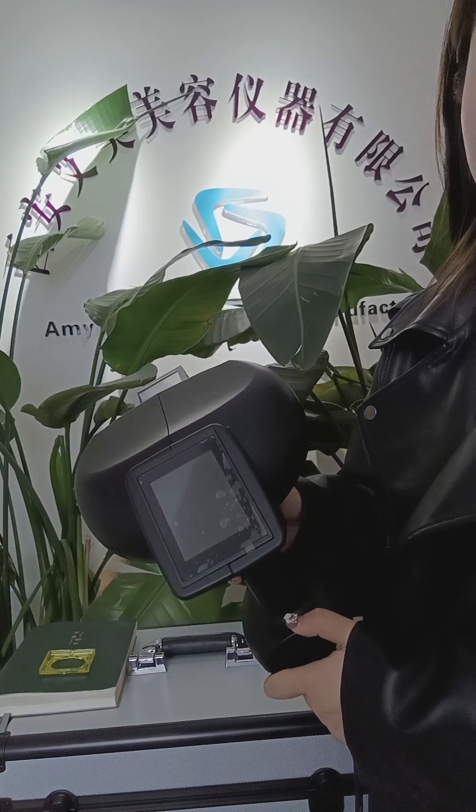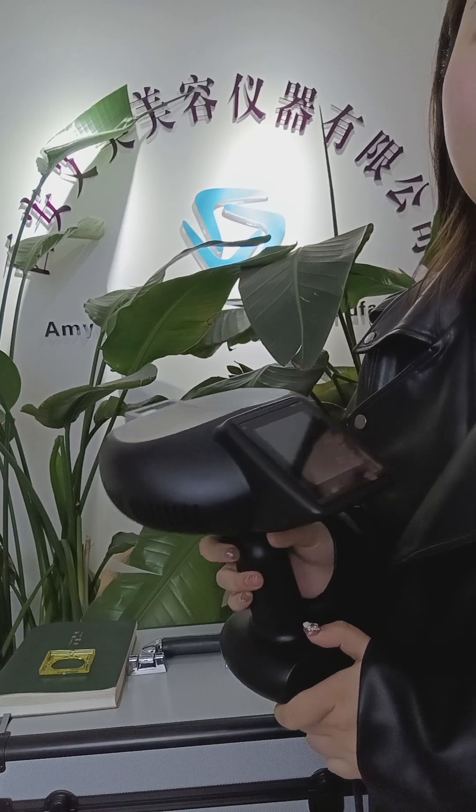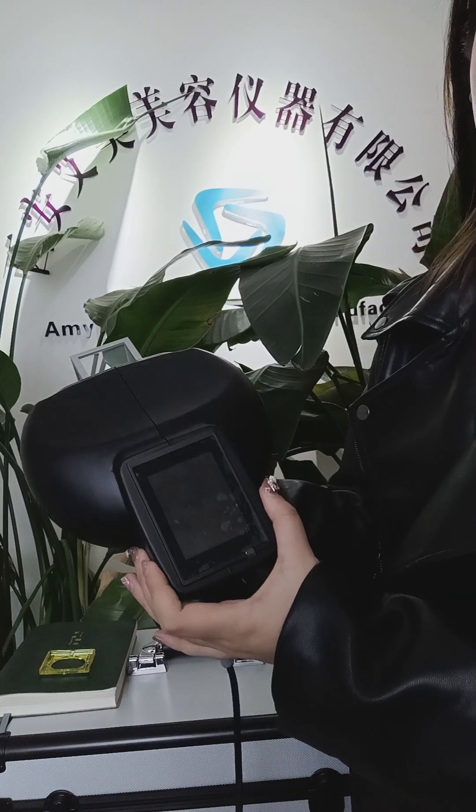Hello everyone, this is Aliyah from AnyBeauty Manufacture. This is our 308 nanometer UV light machine.